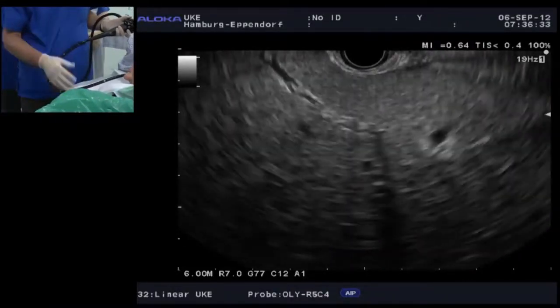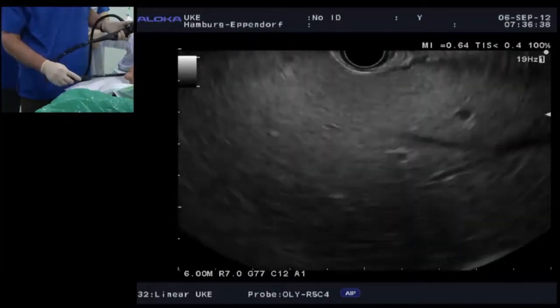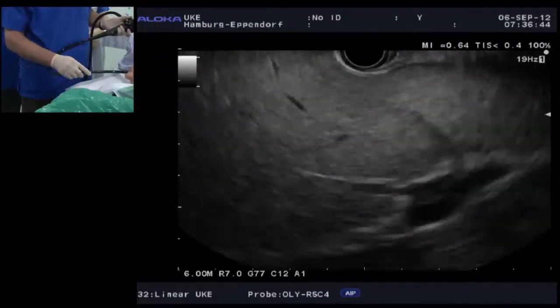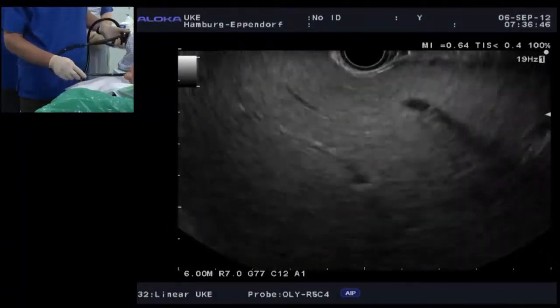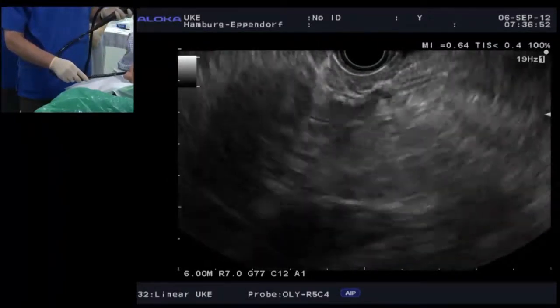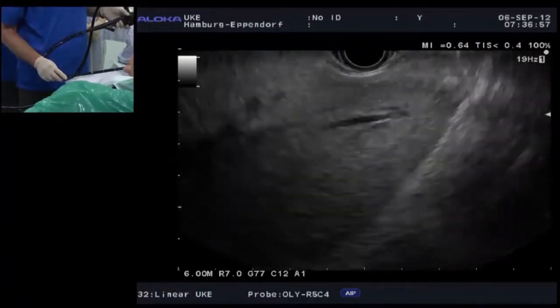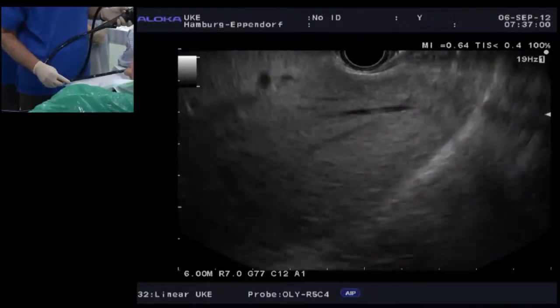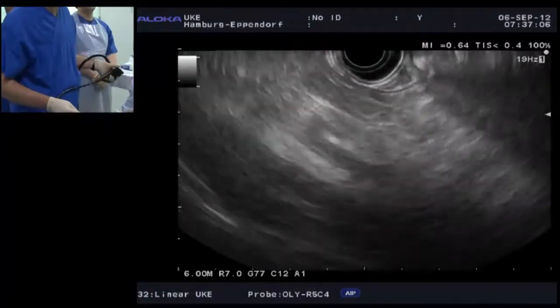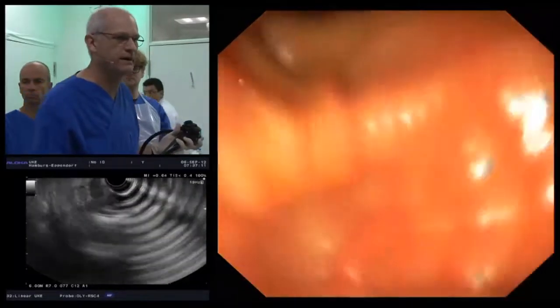A systematic review of the liver requires looking at it from the antrum, looking at it from the duodenum, and then looking at it as you torque right after the celiac artery takes off, or rather torque left, counterclockwise. So those are the stations for the liver. I haven't systematically done that, but I don't see anything in the liver, and nothing was reported on the CT scan. So if it's okay, Mike, I'm going to start out with, obviously it doesn't inhibit me from doing something later on, the pancreatic head.